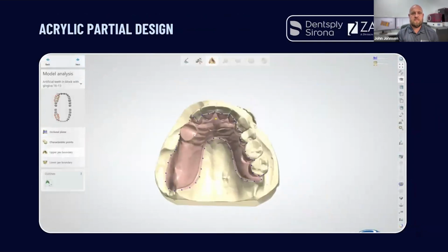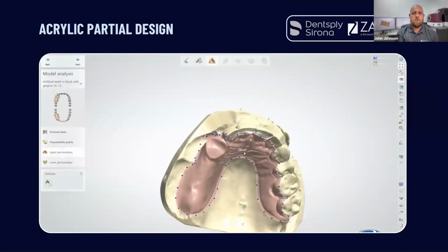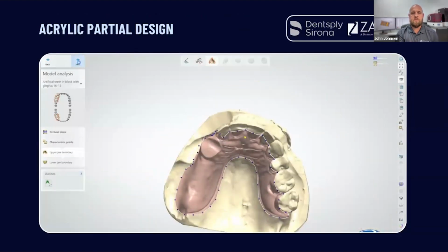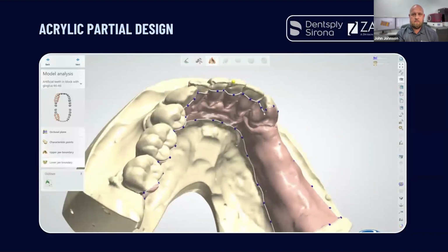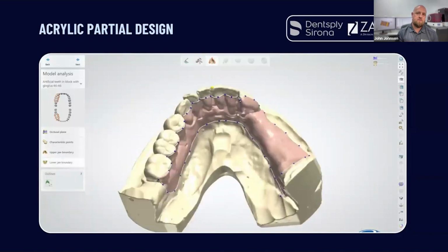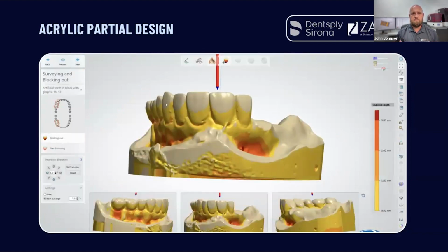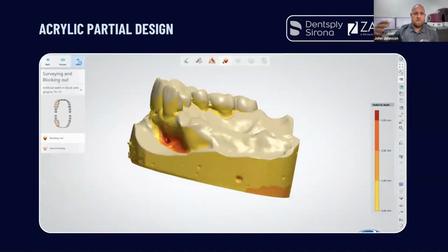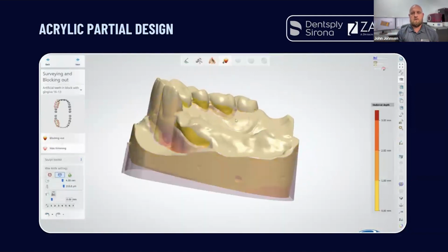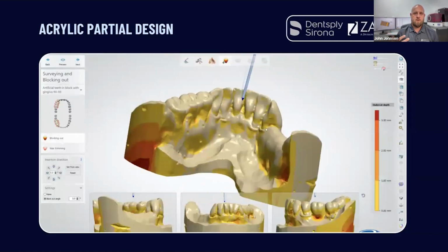So you see the characteristic points, even though there's teeth present. One big thing in design, if anyone is designing with 3Shape and using LDP, you see how I'm overlaying that tooth. That gives the software, when you move into that base generation, something so it doesn't trip it up when you get there. Now you get kind of a funny output because it's going to give you that minimum thickness that you ask for. But you're able to come back and reduce that with your sculpting tools.